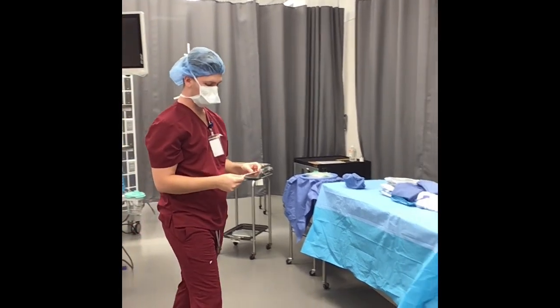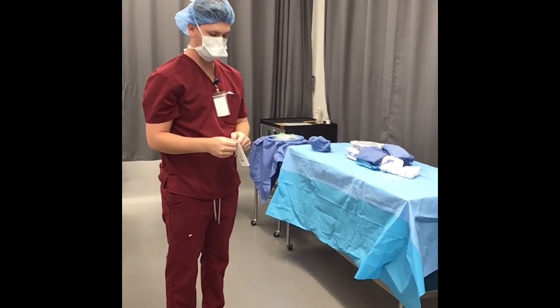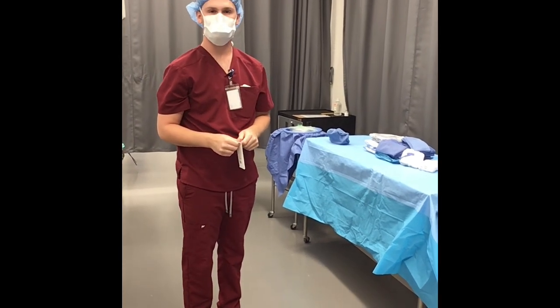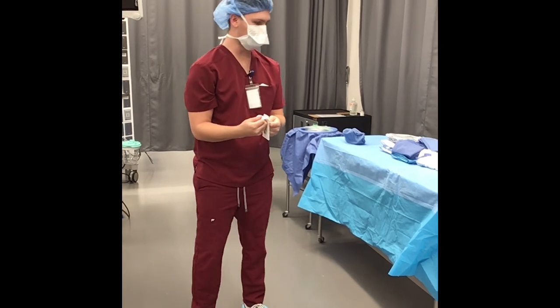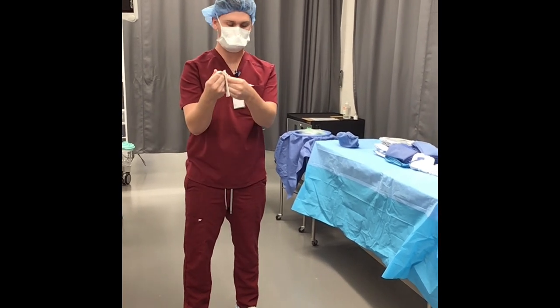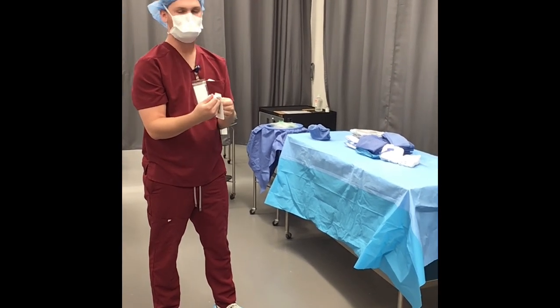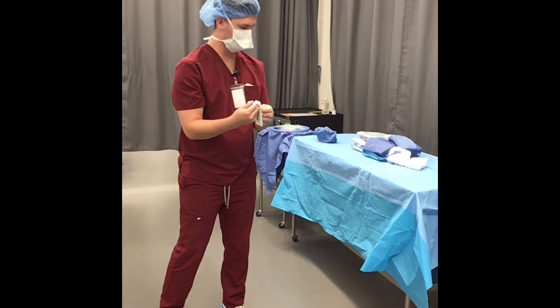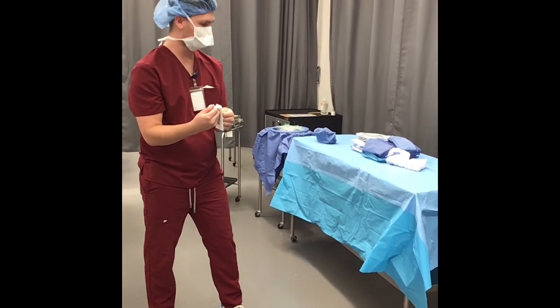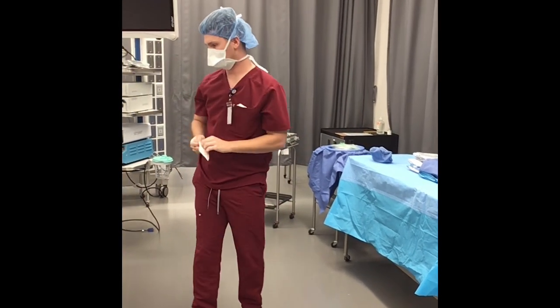Okay, next I have my suture. With suture, I don't want to open this up all the way, so we use a concept called crack and shoot. So I'm going to crack the package. I'm going to rotate my body so, I'm right-handed, I'm having my right hand to the back side. Then I'm going to keep my left hand stationary while my right hand goes over top my left hand while I rock forward. So rock forward, right over left, just like so. Check wrapper, that looks good.